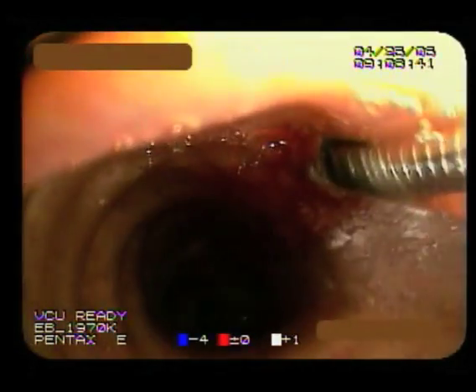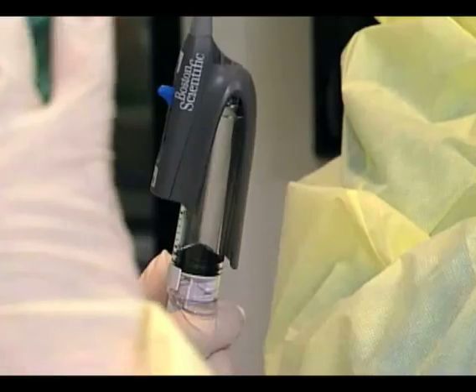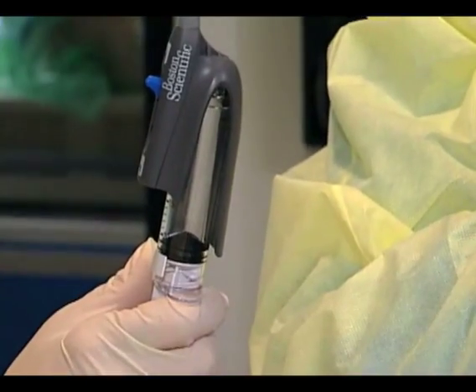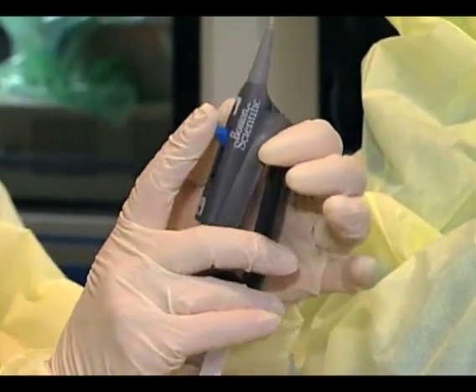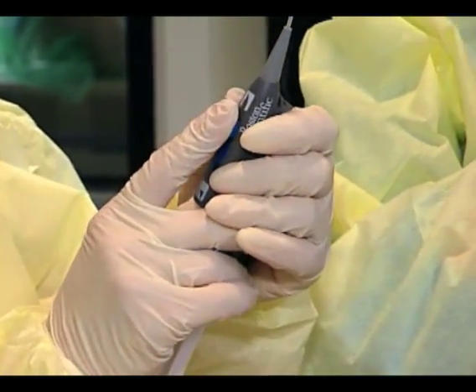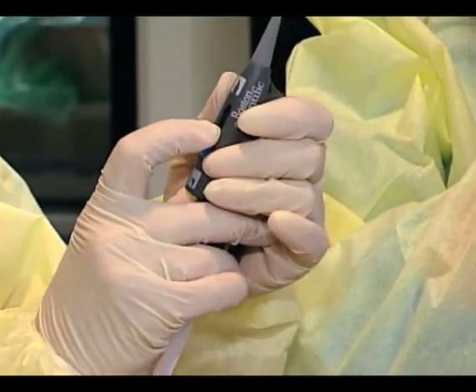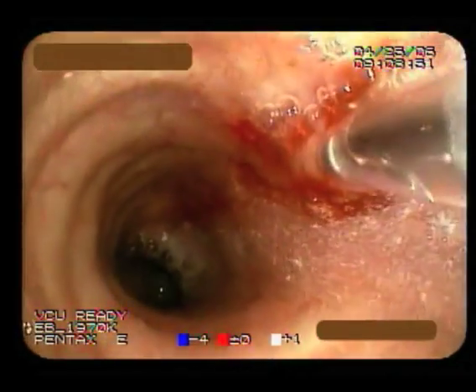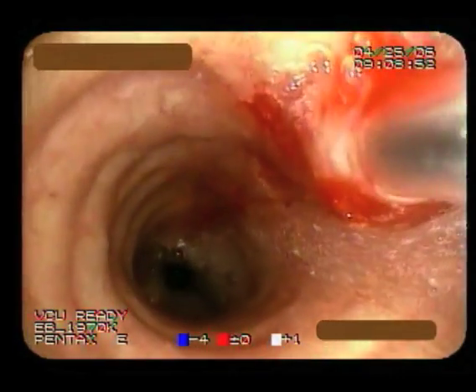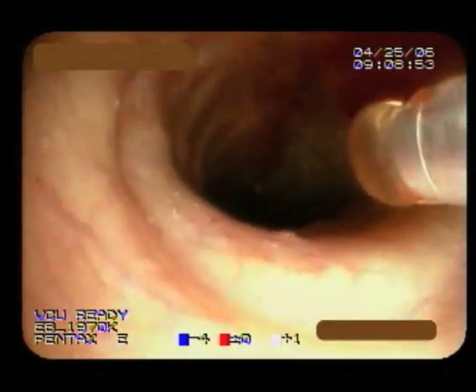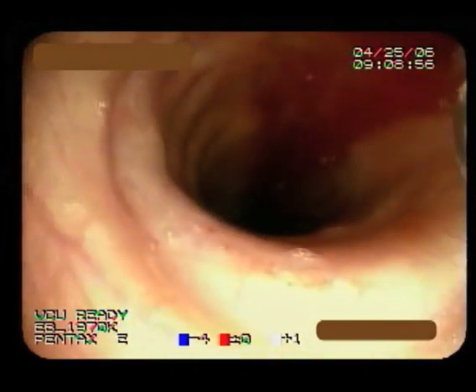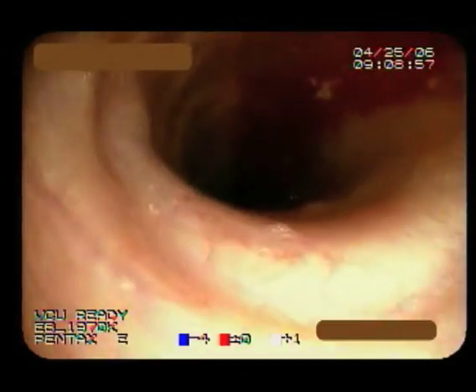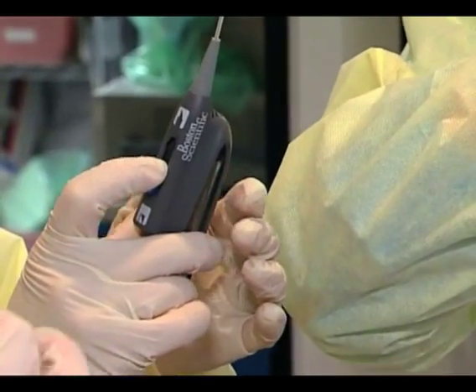I'll do this for approximately 30 seconds, retrieving sample with suction. Once it's been 30 seconds, I ask my assistant to place the needle in and she communicates back to me. Then I just confirm with the camera that my needle is indeed back in its working sheath, so as not to cause any damage to the scope.